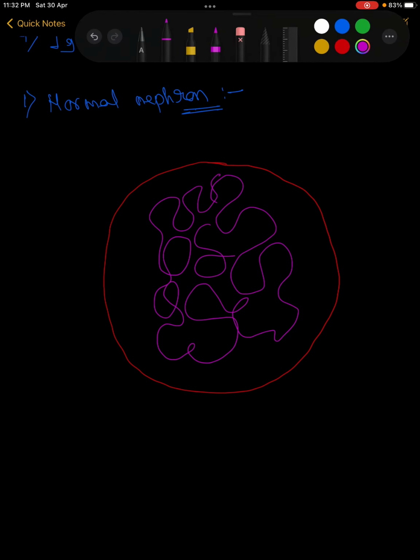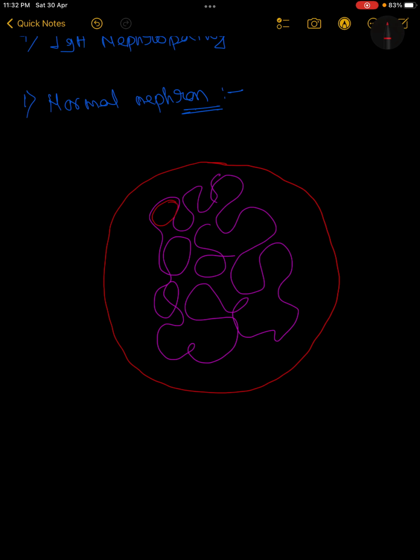Now we will see. Let's think about this as all the capillaries' lumen.